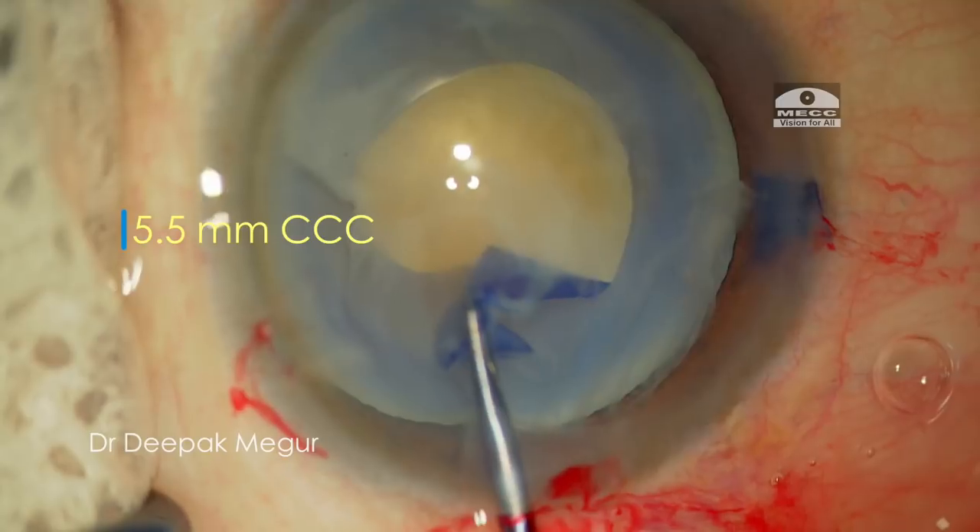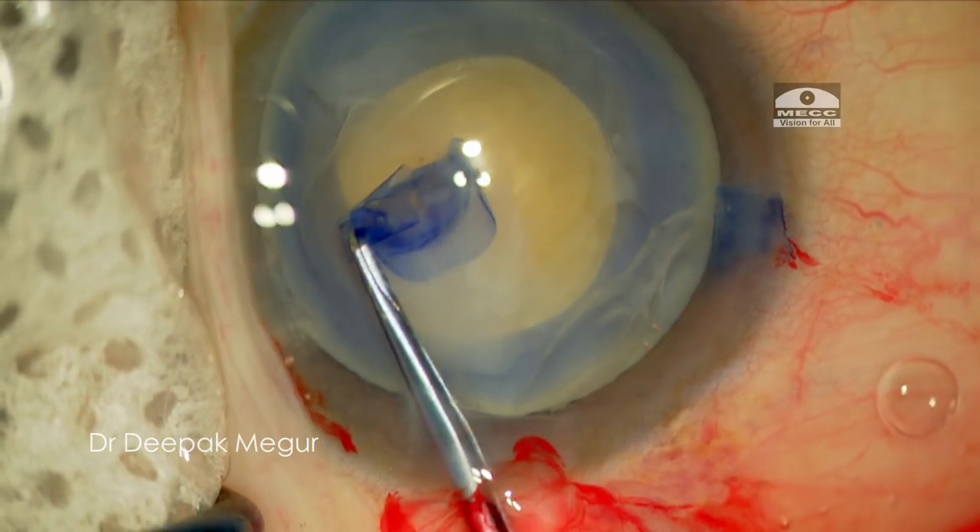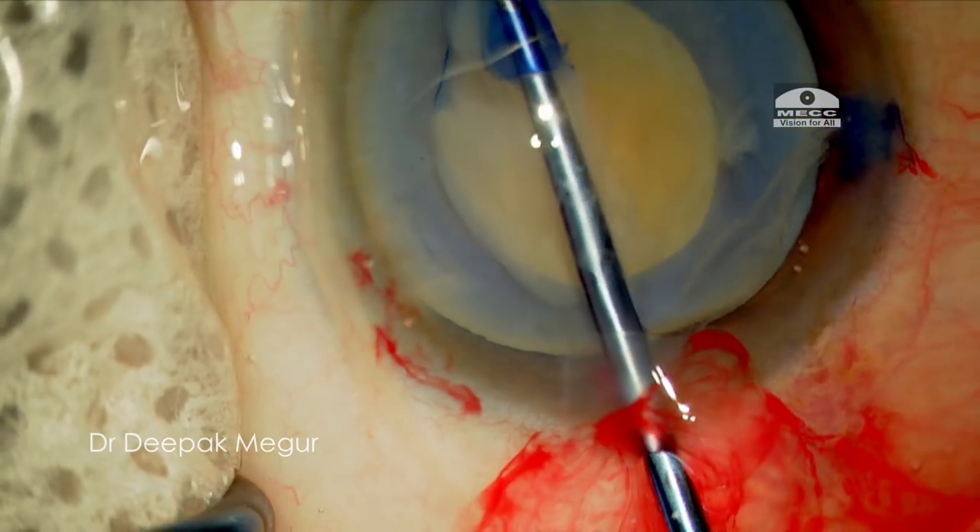Now coming to the chopping techniques, we can do both the vertical and the horizontal chop. In this case, first I will demonstrate the vertical chop.